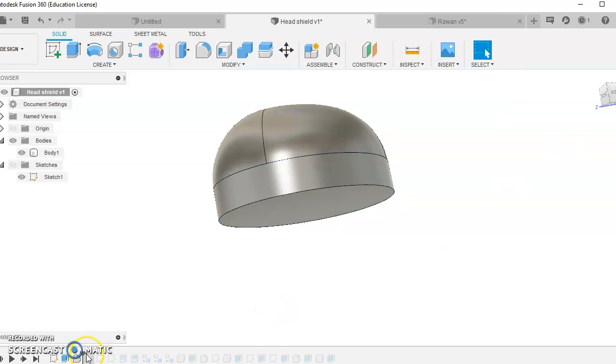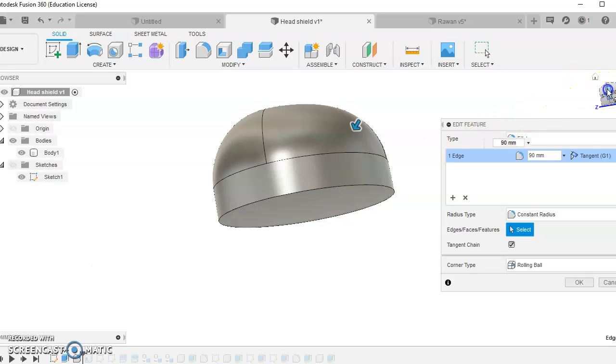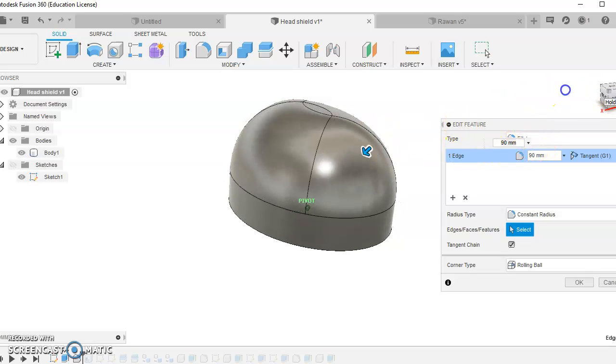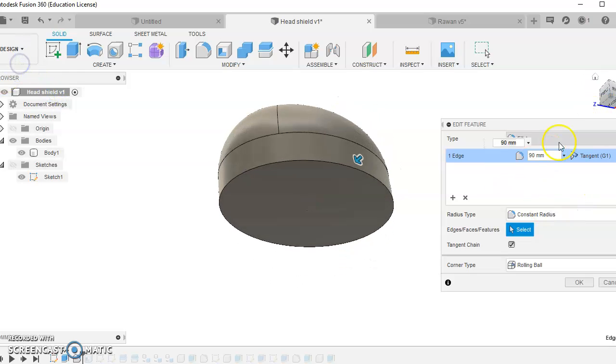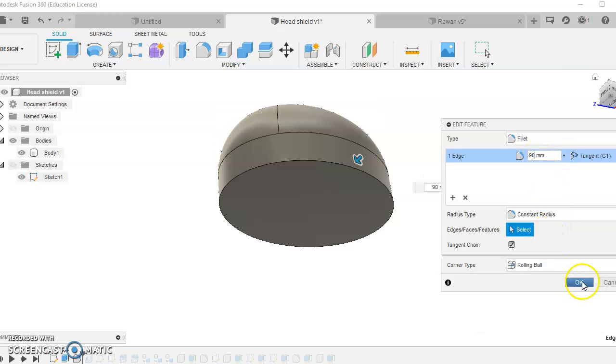Once you've done that, the next stage then is to shell the inside. Now the way in which we shell an item, edit feature, if you look here, I put a radius on that top corner of 90 mil, right? And that will just follow the profile of the helmet. At the moment that looks like a mountain bike helmet. But if I change that to 100, I'll show you now, look what happens. It won't let me do it. So 90 is the limit. And when you look at the design, when you look at the 90, it's right because the computer's worked out all the diameters and all the information from the original sketch, and I said that 90 millimeters is your limit.